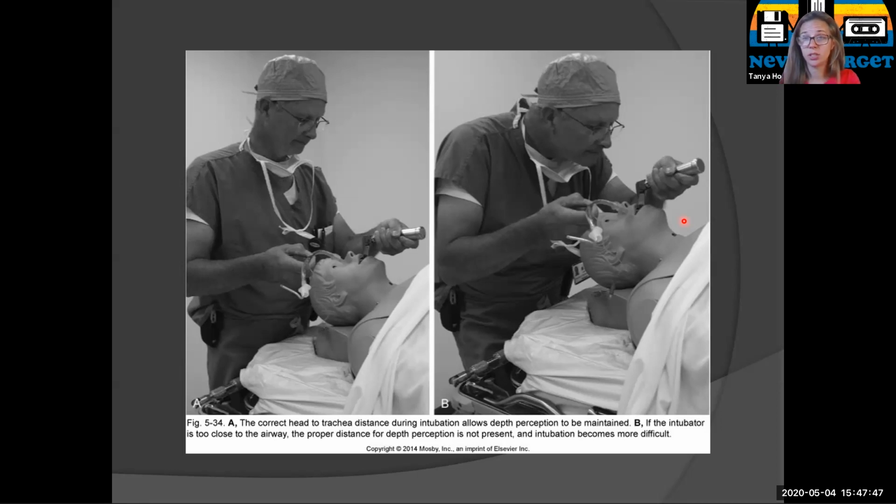Somebody who goes in just to get knee surgery comes out with their knee but no front teeth, that's going to be a big lawsuit, right? In the hospital scenario, we are worried about these things, okay? So you do not want to crank back on that handle, okay? And sometimes it might help with visualization, but if you're struggling to visualize, you need to fix something.